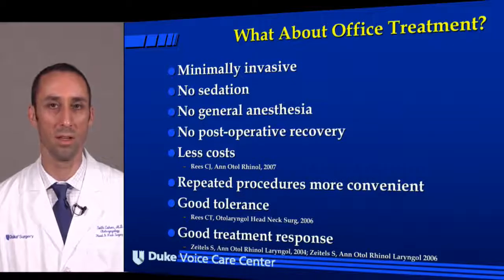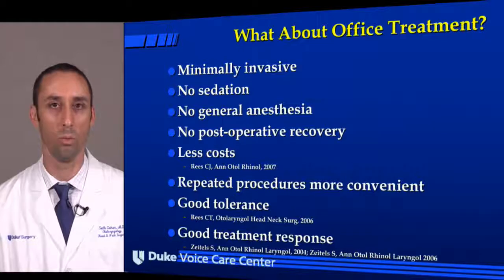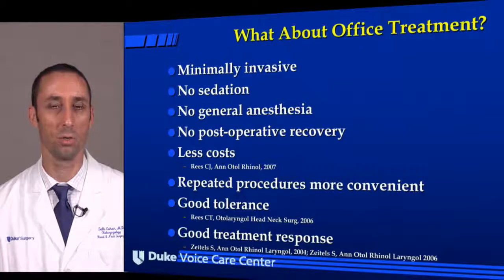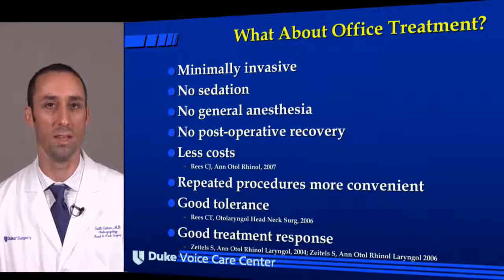We've progressed, and now we can talk about office treatment for various lesions. Why the move to talk about office treatment and consider this in our patients? Well, it's minimally invasive. There's no sedation required. This is all done under local topical anesthesia, so we can avoid the morbidity of general anesthetic. The postoperative recovery from an anesthesia standpoint is avoided. There are studies that show that this is less costly than doing surgery in the operating room.